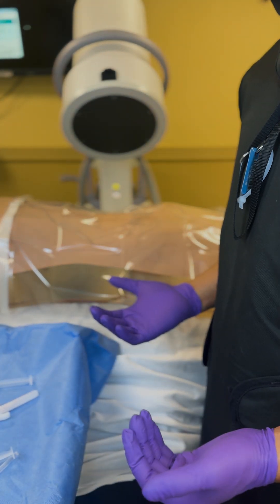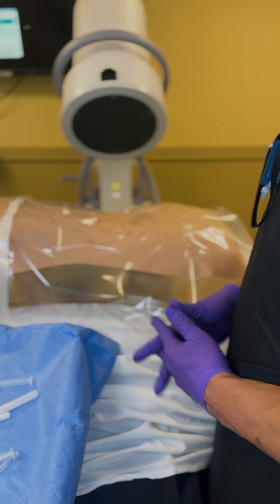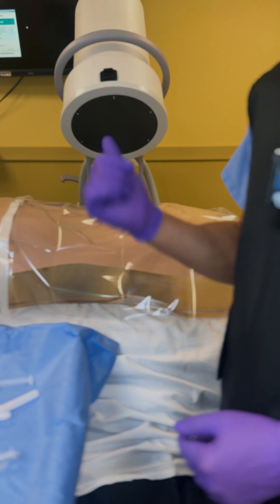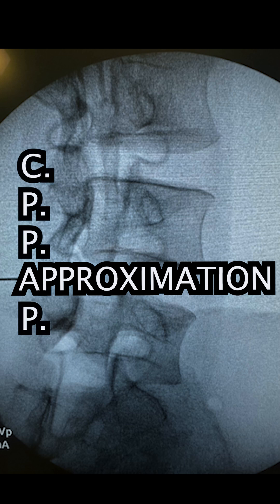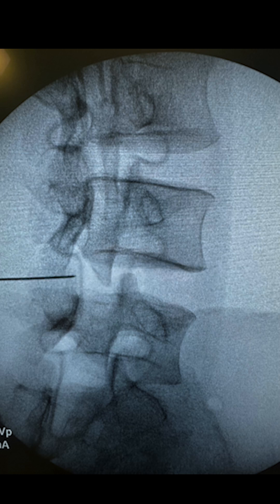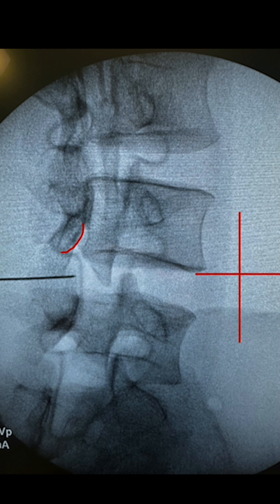Our next step is obtaining a contralateral oblique, or CLO, view. Since our injection is on the left side, we oblique 45 degrees to the right to assess the L4-L5 interlaminar injection. A CLO view is used to assess the depth of the needle, whereas the AP view addresses medial-lateral and superior-inferior positioning. Switching to a CLO view is not as simple as going to 45 degrees, due to variability in individual anatomy. A true CLO view is the angle by which a line parallel to the lamina intersects the midsagittal plane.